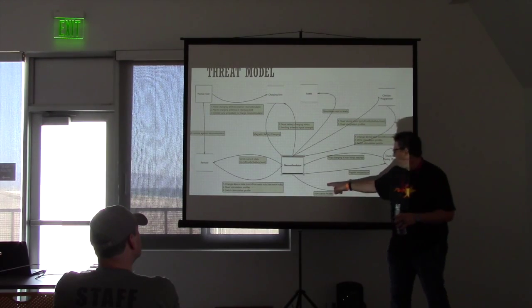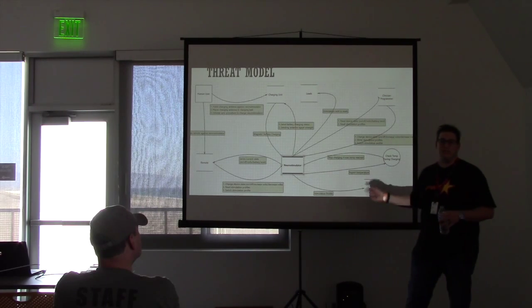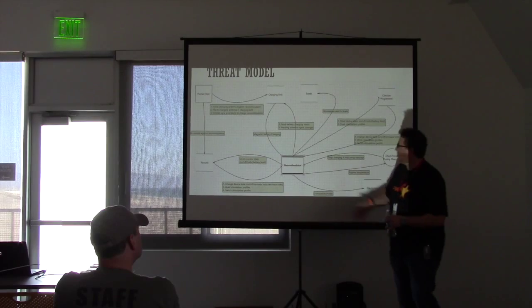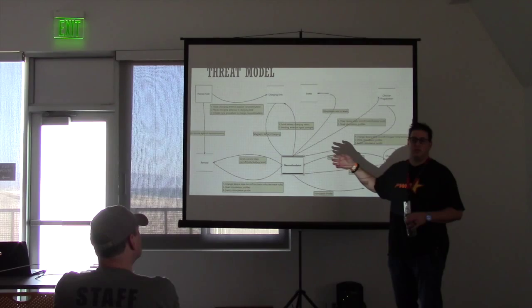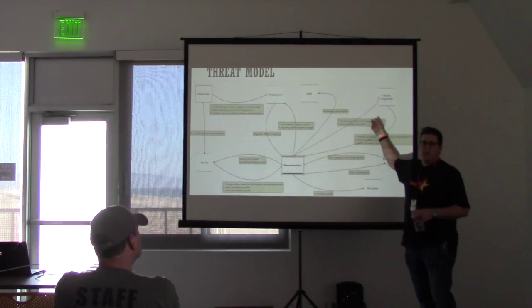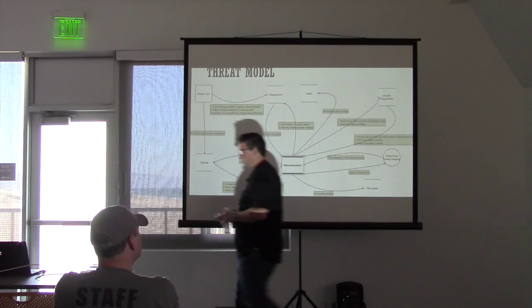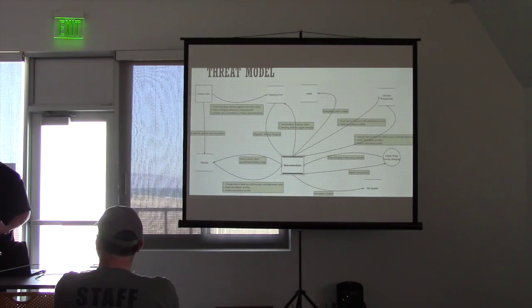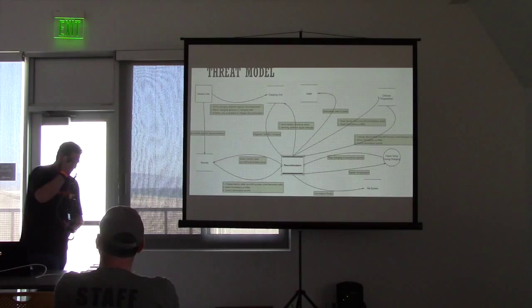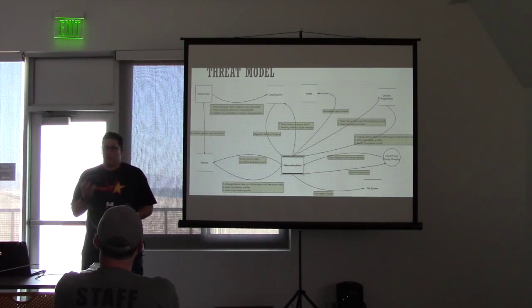And so, again, we've got what are called stimulation profiles, of which you can have multiple that are stored in the device itself. And the human interaction, because of the range or the lack of range on these devices, whether it's the programmer, the charging unit, or the remote, it's less than half an inch. And so let me just show that for a minute. This is the charging unit itself. You do plug this into the wall. This is the battery product that tells you what the signal strength is, so when you're charging.